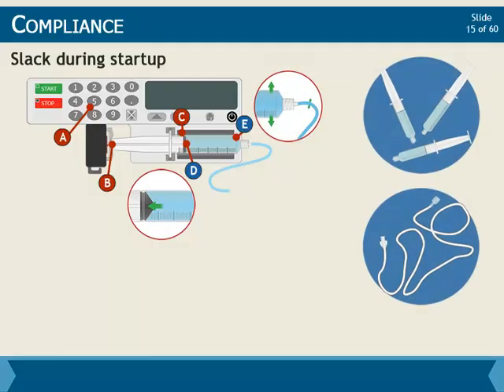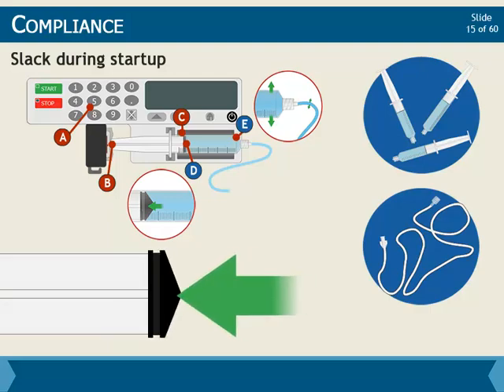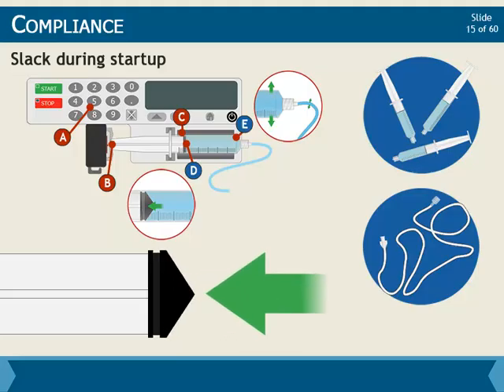Different makes and sizes of syringe and tubing can have different degrees of compliance. The compliance of syringes tends to have a much larger impact on delivery because of their much greater diameter when compared to IV tubing. You can see just how compliant syringes are by pressing on the rubber plunger head and noticing just how much it moves while applying an increasing force.